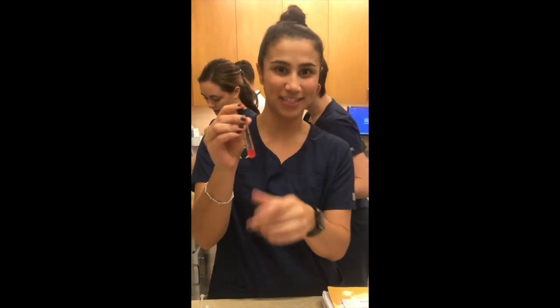So this is our 2% erythrocyte suspension for our recipient tube. Just gonna put this in here, and now I'm gonna do the same thing with our donor cells.